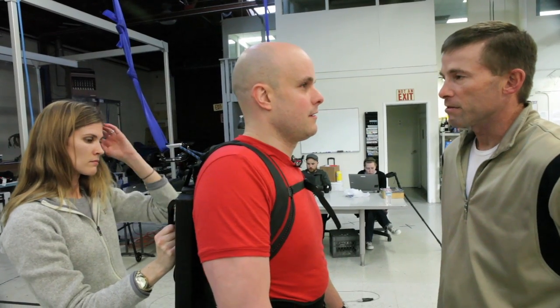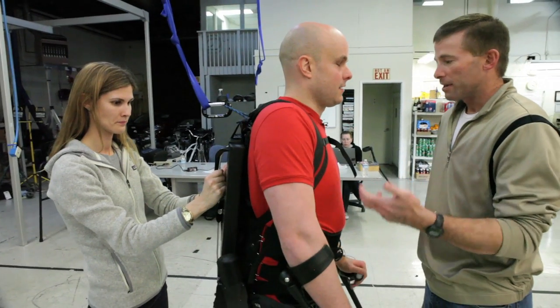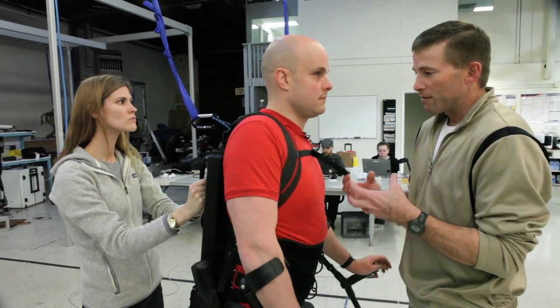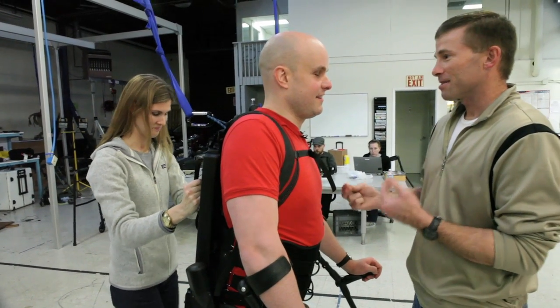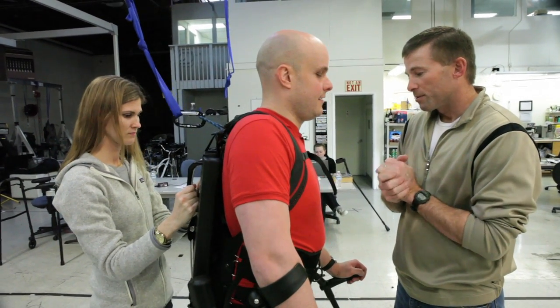So let me just tell you — only about a third of the people I work with move to crutches in their first session. Out of about 60, I can get 15 on the crutches. And that's when they can see what's going on and see their mistakes with a little more input. You're having to rely on our words, and I'm not sure our words are as good as they need to be at times to help you figure it out. So you're doing very well.